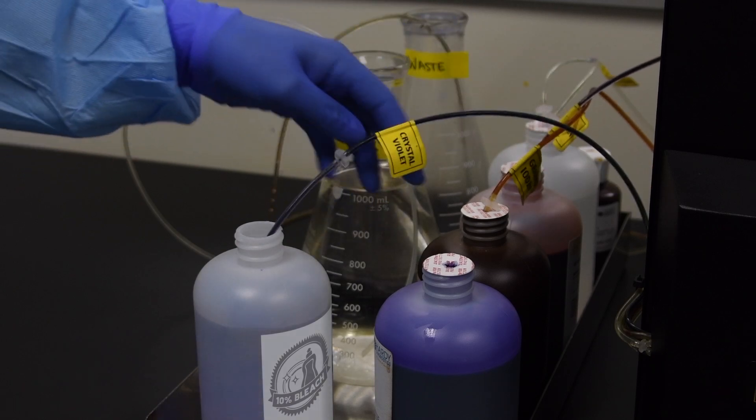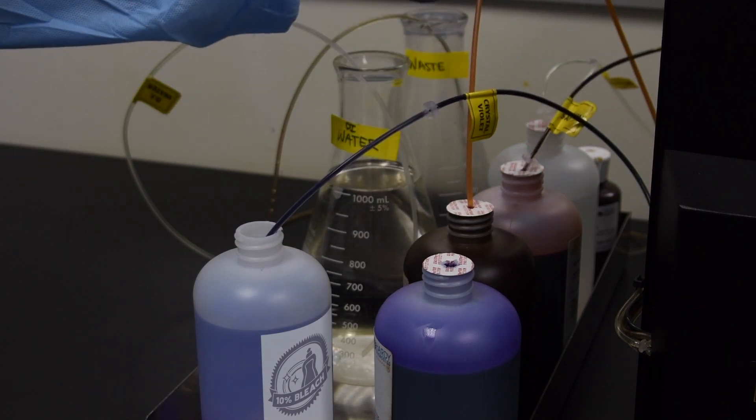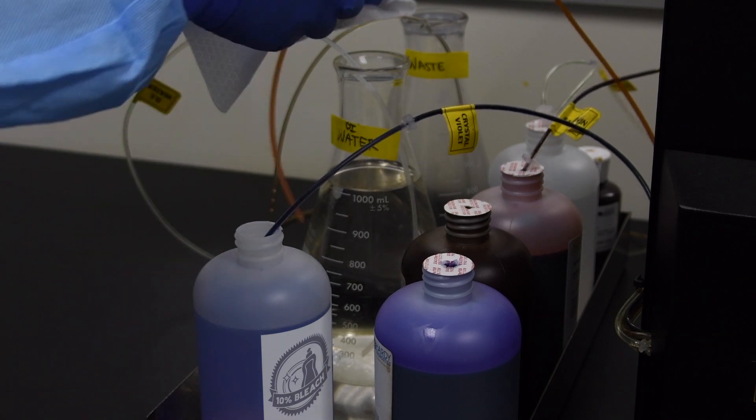For a bleach cycle, place all reagent cannulas into approximately 500 ml of a 10% bleach solution.